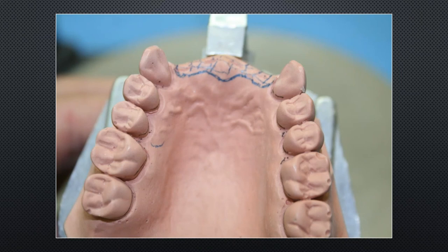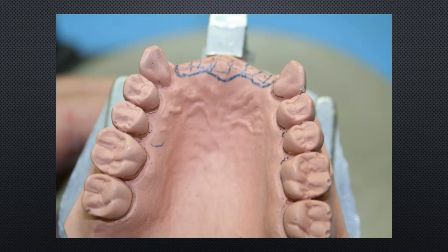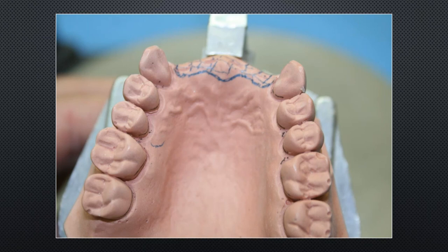Some textbooks show eye-bar or roach clasps on the canines, which is unsightly but reserved for extreme cases to minimize rotation. Step one of the design process is to outline the edentulous area — the patient came for the four anterior teeth (centrals and laterals). Draw the internal finishing line, keeping the incisive papilla in the acrylic saddle portion and possibly providing relief.